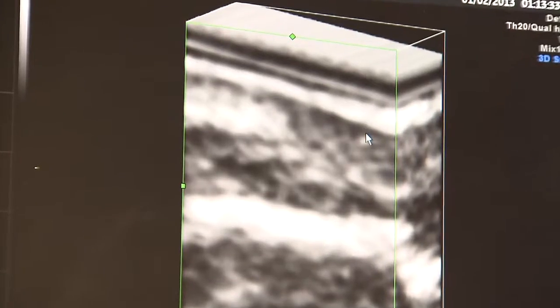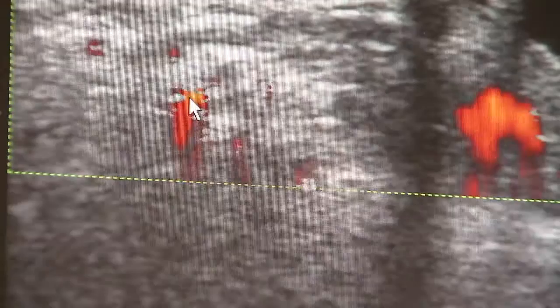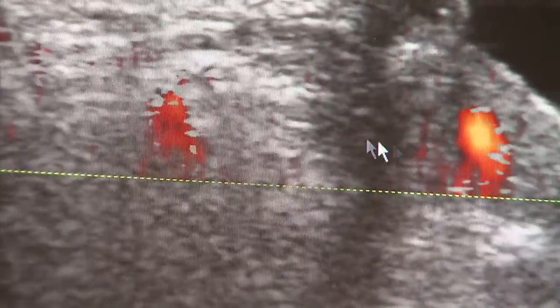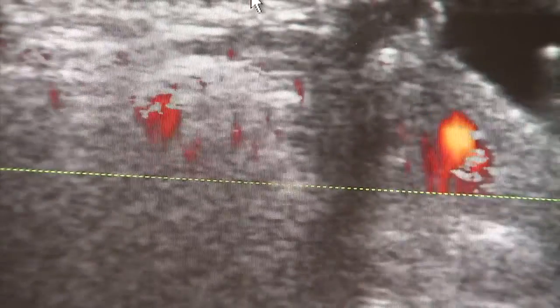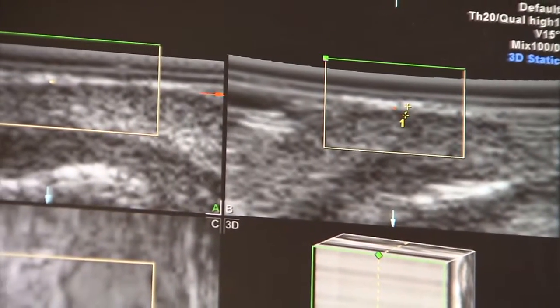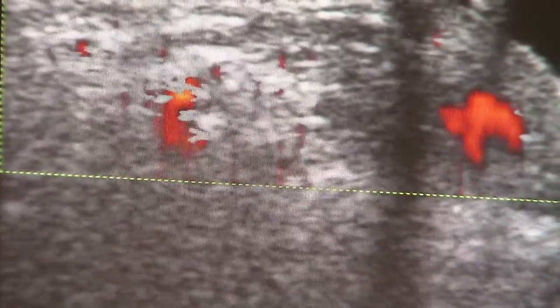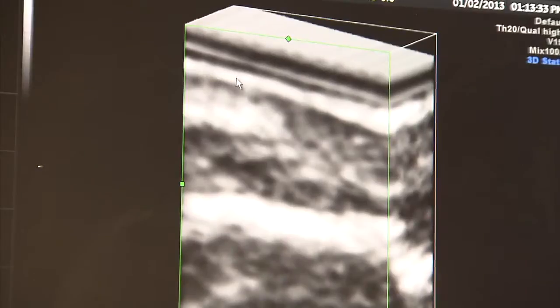If there is a tumor that's growing under the skin, using robotic technologies, computers and MRI or ultrasound, we actually fuse them together. We put the laser fiber into the area that's abnormal, and you heat it using the laser. You can also control the spread of the heat or the laser fiber's energy so you don't damage other tissues.